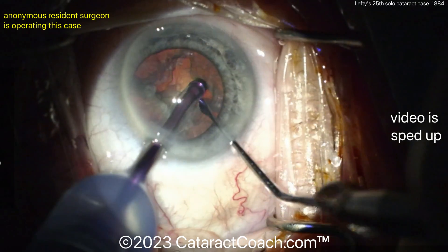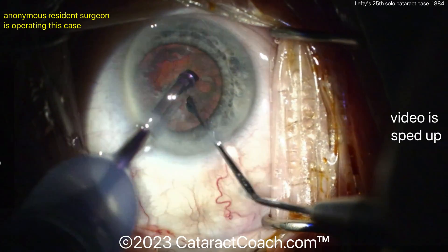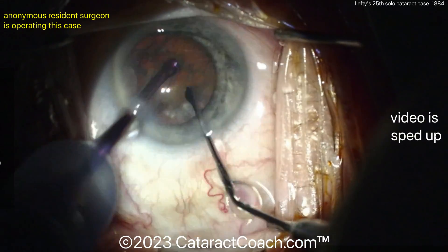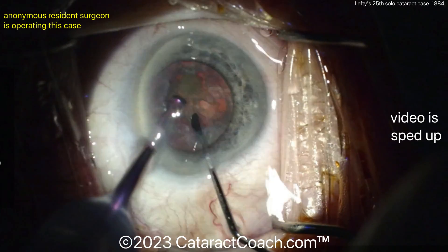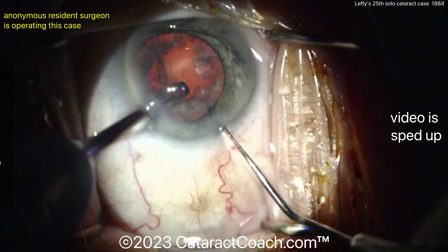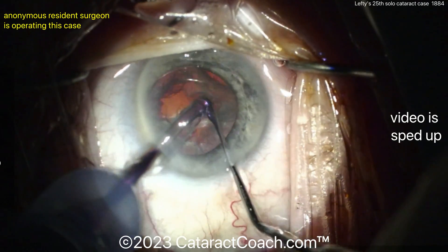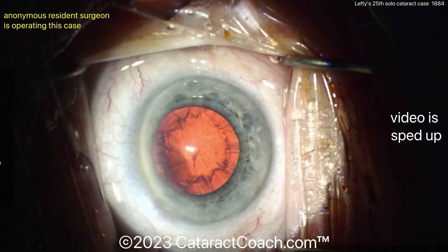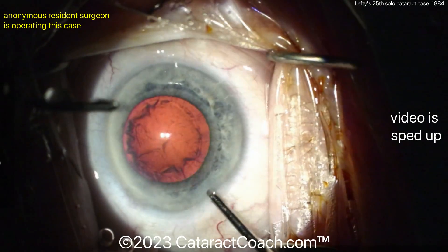Put that left hand down a little bit to get the eye back in primary. See those two light reflexes? I need them on the center of the cornea — they're not on the center of the cornea. Now they're getting better. This eye is being shoved away from you because you're lifting up the probe hand. So this left hand with the phaco probe needs to be put flatter, making the phaco probe more parallel to the floor of the room and getting that eye back into primary. At this point you can certainly tell this is a novice surgeon because the eye is not staying in primary — this is a skill that just takes time to learn. See how the eye is being shoved towards the top part of the screen? That's because the phaco probe angle is off — you're angling it too steep instead of more flat or parallel to the ground. Now look — see the light reflex in the middle? That's where I want the eye to stay as you operate, with the patient looking directly at the lights and the Purkinje images in the center. That's ideal.